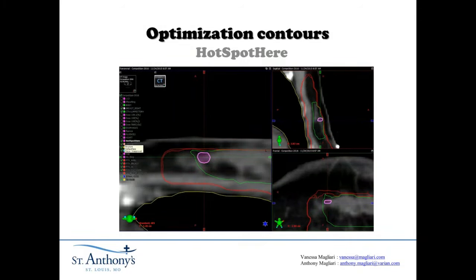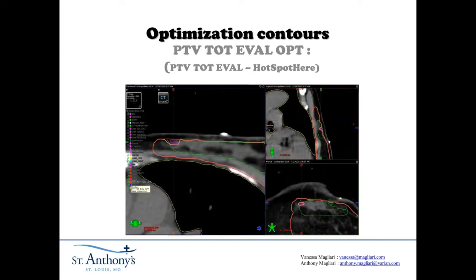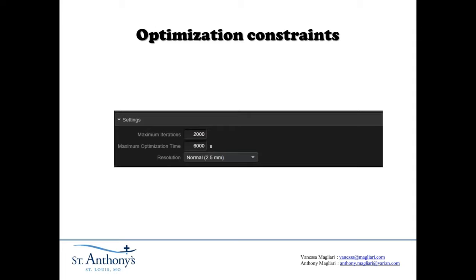We created a hot spot structure here — it's a special structure to try to have the hot spot inside the lumpectomy. Our PTV total eval opt removes the hot spot here just to avoid conflict in the optimizer. For the optimization constraints, we put a maximum iteration to 2,000 and maximum optimization time to 6,000, and used a resolution of 2.5 millimeters. Those are the maximums allowed in version 13 for your iterations and optimization time.